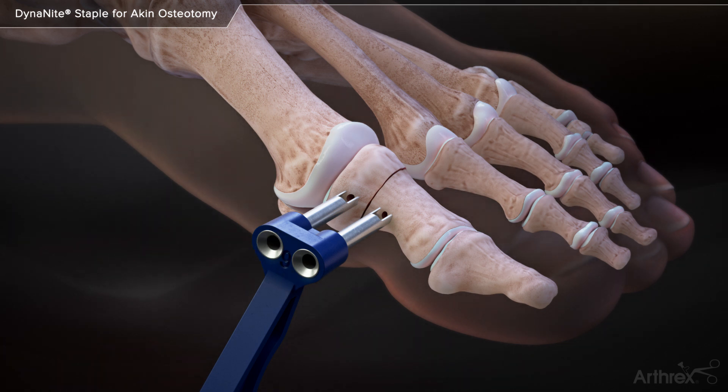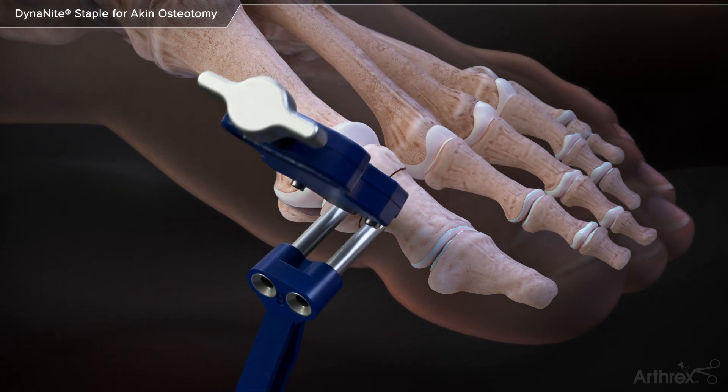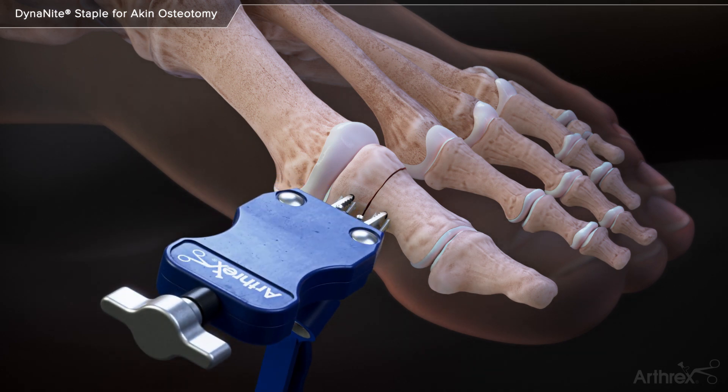The drill guide is held against the cortical surface in order to maintain the location of the drill holes. Using the windows on the drill guide, the staple legs are inserted into the drilled holes. The drill guide is then removed.